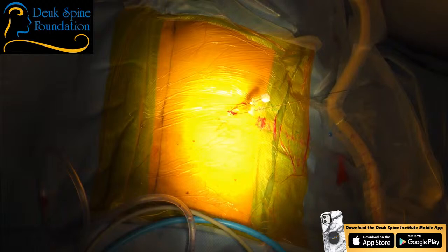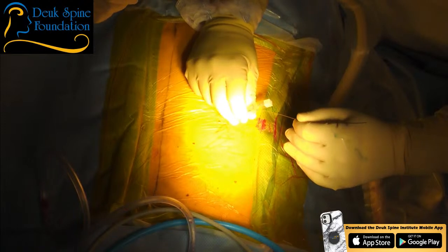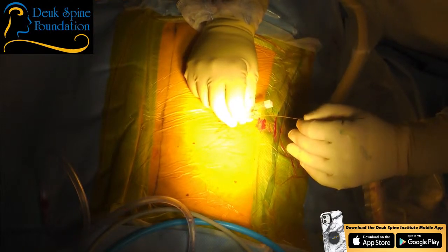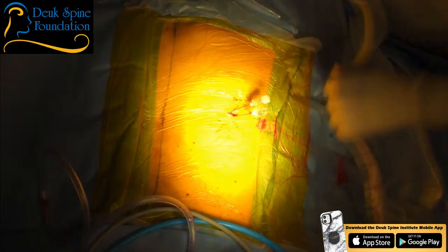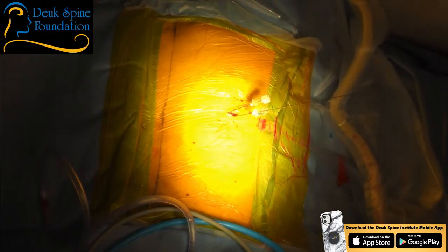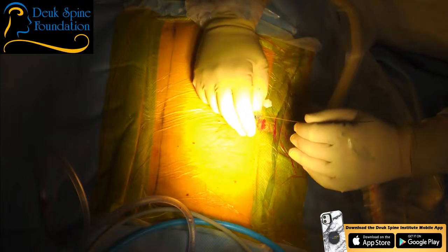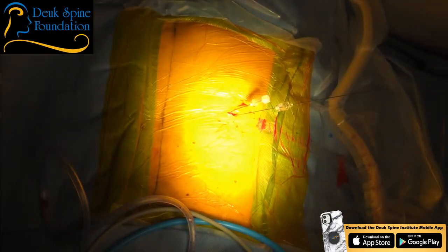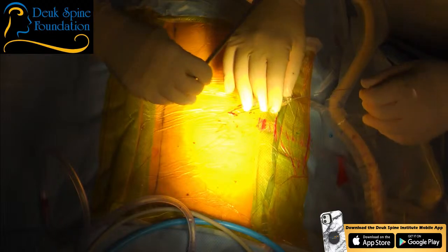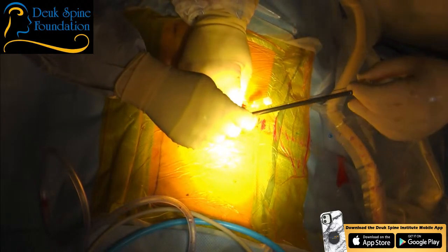Shot? Okay, I'm trying to take the needle out and leave the guide wire in. We're at L4-5. You can see there's still a lot of dye trapped in that disc, right? That's the black stuff in there, okay? So if you don't know where we are, Shot, we're at the second needle, the bottom one. And that is the L4-5 level. There we go. I just took the needle back. You can see a change now. And you still see there's a guide wire there. I'm taking the needle out, but leaving the guide wire.